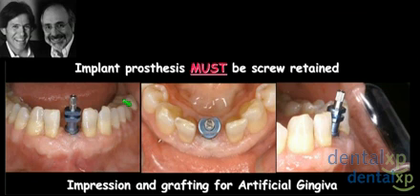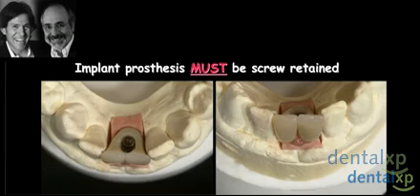You can see that we've deliberately placed this lingually because we know we're going to add some prosthetic phase to this, and the screw is actually going to be through the back of the papilla, and that's kind of what we're aiming at deliberately in this. Now you can see where the screw comes out between the two teeth, so you've got kind of a half a pontic on either side.